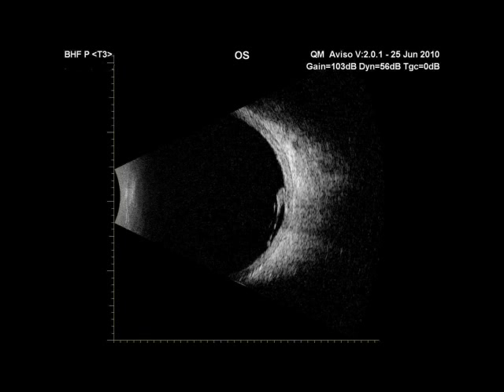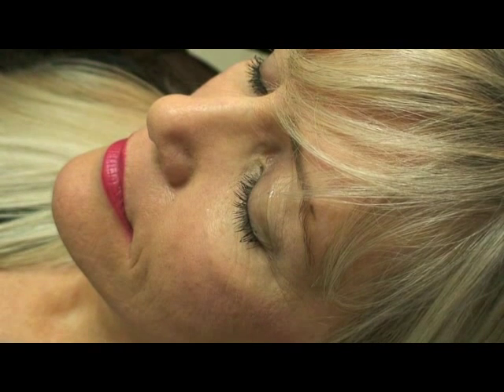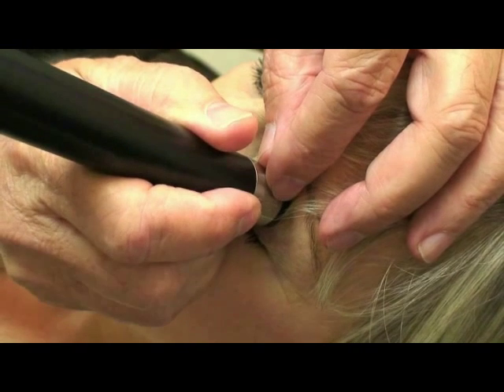Is the fovea thickened or detached? With the patient looking down, cup your right fingers holding the probe and make micro-movements. I am steadying the probe with two fingers of my left hand. Generally, I drape the transducer.